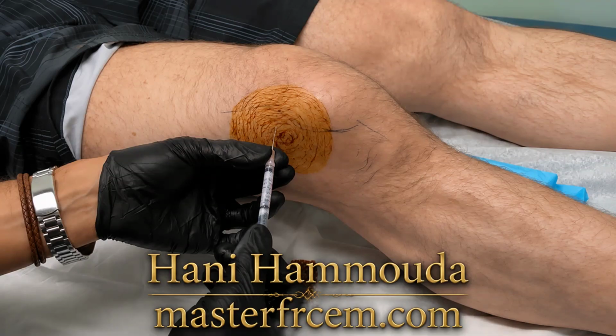The first thing you want to get is your landmark. So your landmark is 2 centimeters lateral to the lateral border of the patella. Then the direction, you're going inferior and posterior to the patella. Then with the knee already semi-flexed or extended 25-degree, you clean the area with your chlorhexidine, cover the area with a sterile drape, exposing the landmarks. Then you want to numb the area with lignocaine, 5 mils. The maximum dose should be 3 milligrams per kg.